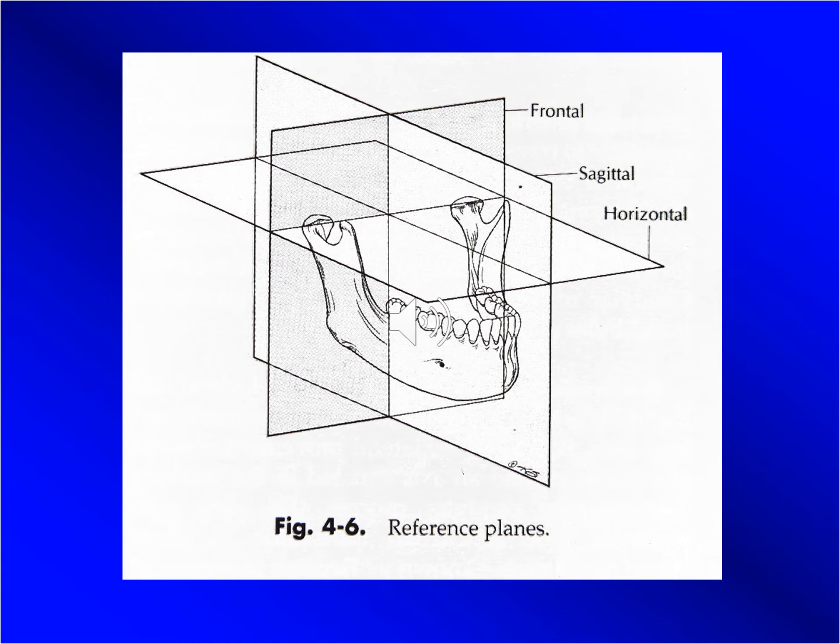If we can reproduce that space in the laboratory by changing the condylar guidance angle on the articulator, then that articulator can be programmed. Of course, that space can also happen when we move the mandible to the right or to the left, and is caused by translation of the non-working condyle. And again, when we try to reproduce that, we can also use it as a tool to program the condylar element of the articulator in a way that will lead us to more accurate mandibular movement of the articulator in the laboratory.